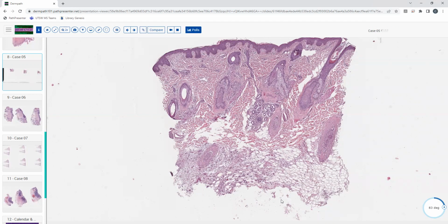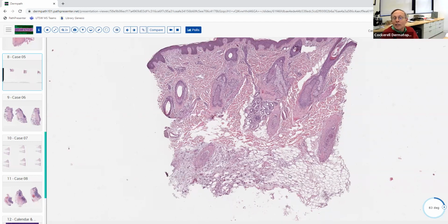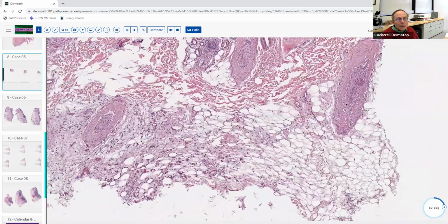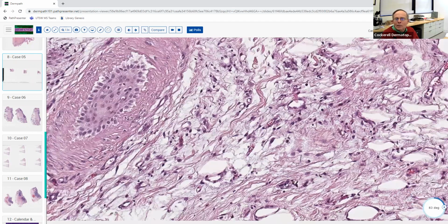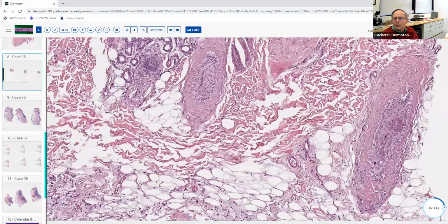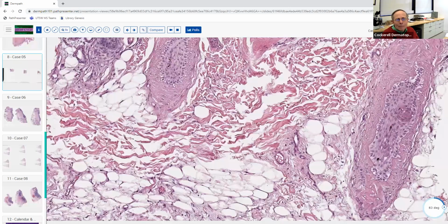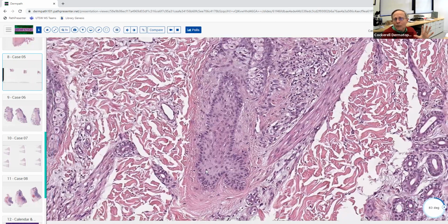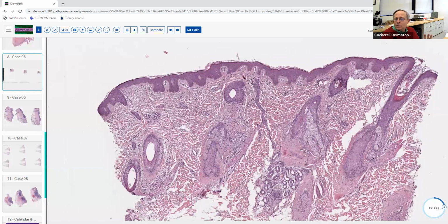But this one, they're all in catagen. I think that can happen in alopecia areata. It just didn't seem inflammatory enough for me, but maybe I'm not seeing that. That's what I want you to see: don't always use that criterion, because this is the only condition that will give you this massive shift into catagen all at once. Whenever you see this markedly thickened glassy basement membrane surrounding these follicles, these follicles have been shifted into catagen, and it can happen without a whole lot of inflammation. So this is the clue to this diagnosis. When everything gets synchronized like this, there's really nothing else that will do this.